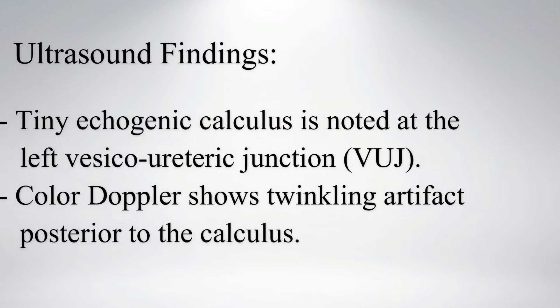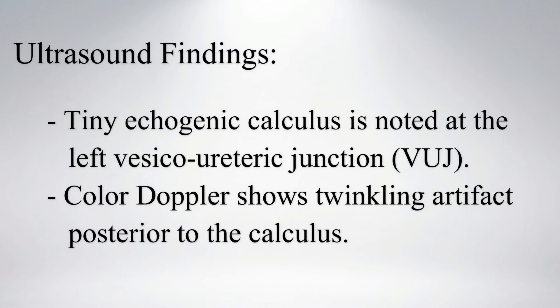On ultrasound, a fixed tiny bright echogenic calculus casting an acoustic shadow is noted at the left vesicoureteric junction. On color Doppler, a twinkling artifact is noted posterior to the calculus.